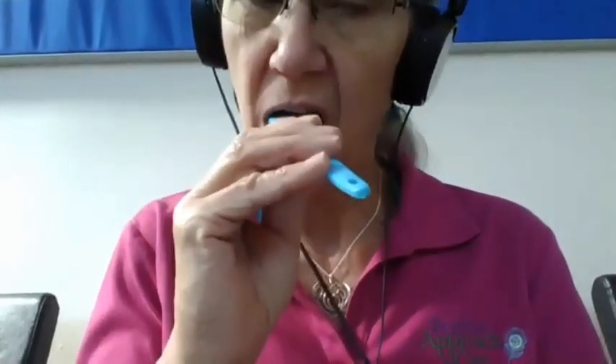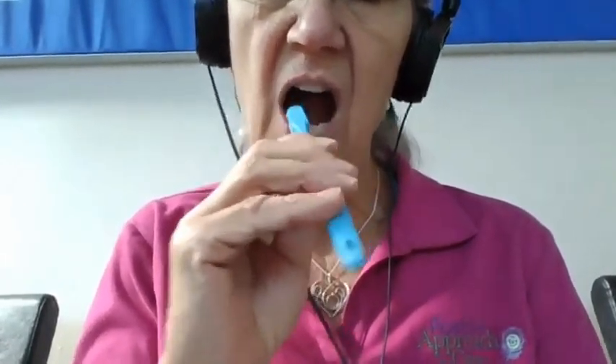There's not as much need to get into the outer edges on each side. This motion allows me to get both sides of the teeth down at the gum line and the chewing surface, and then I've got the front inside and outside. I can also have the person doing that motion themselves — not me doing it to them. For people who like to be in charge of their own mouth care, they're going to be a much more effective mouth caregiver than with any of the current devices out there.